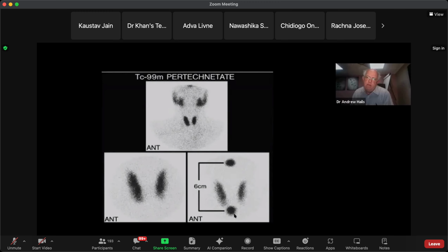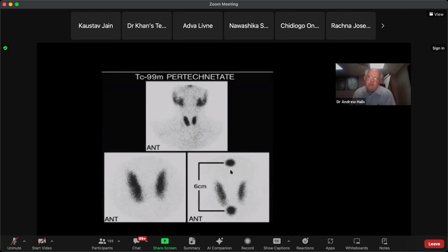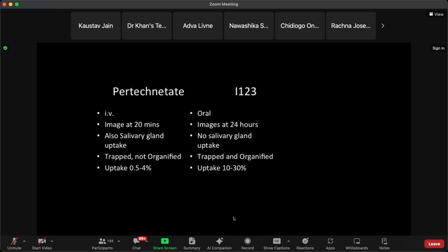It's important to bear in mind with nuclear medicine, you may get a little radioactive pen, which is used to mark a 6 centimetre distance, or you can also put a little coin or some other cold marker, which in fact produces a cold area. And both hot and cold markers are used on nuclear medicine scans.